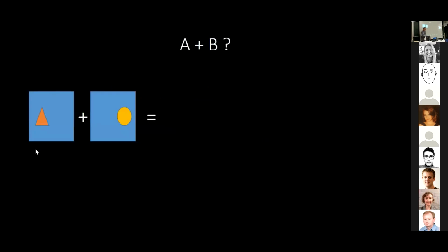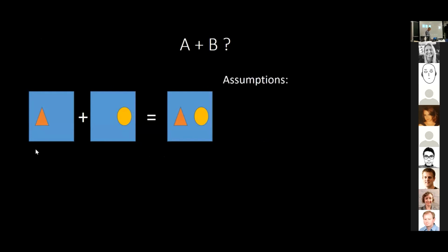One important question: you're adding two images. And what do you expect, or what should happen in, of course, relation to my library? If you add two images, what should happen? Well, you might expect something like this. We're adding these two. But is this true? Of course, you're making some assumptions, like that these two images have the same shape, that they are taken from the same position in the patient.